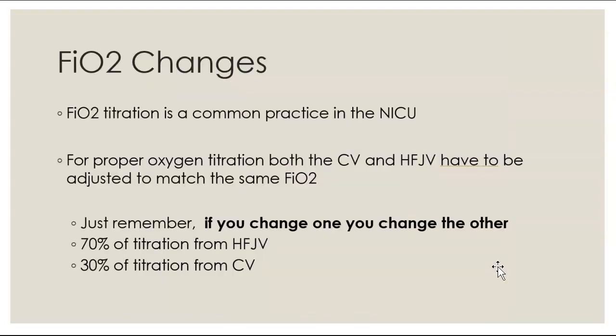FiO2 changes. I know all of you at this point in your life know how to titrate FiO2. It is a very common thing in the NICU, especially when you have a kid with a PDA, right? We've all been there. One thing with the jet, though, is it has a little bit of difference when you're adjusting the FiO2. So, for proper FiO2 oxygenation titration, the conventional ventilator and the jet have to be matching on their FiO2. If you change oxygenation on the Draeger, you have to change it on the jet. If you have changed the oxygen on the jet, you have to change it on the Draeger. 70% of oxygen titration comes from the jet, 30% from the conventional ventilator.